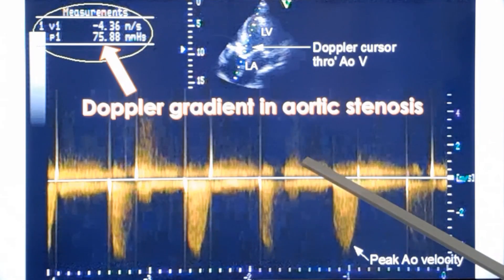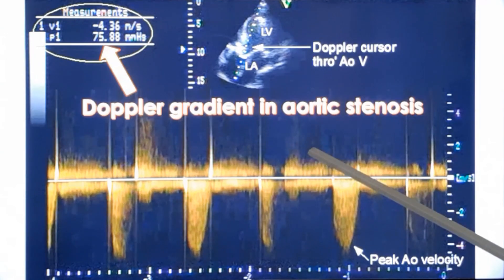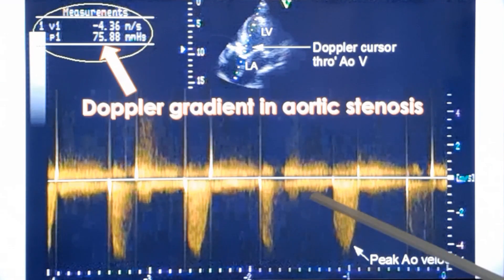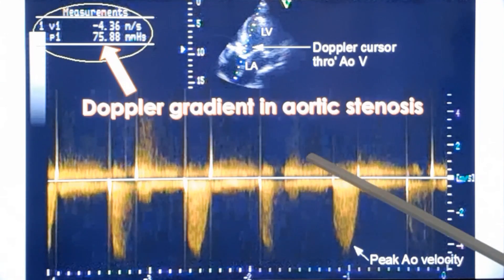And when there is a significant gradient, it is aortic stenosis. This is from an original case recording, while the previous one was a diagram.